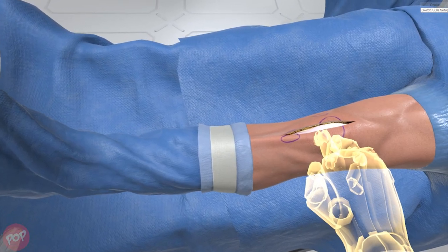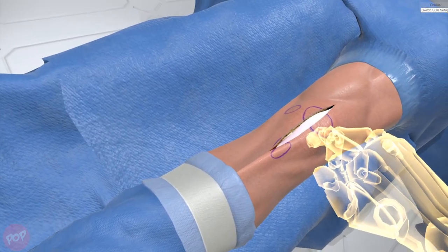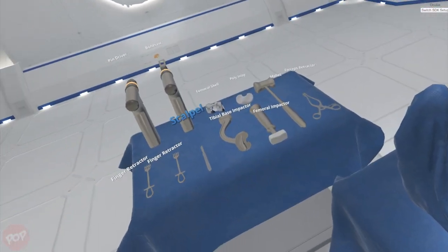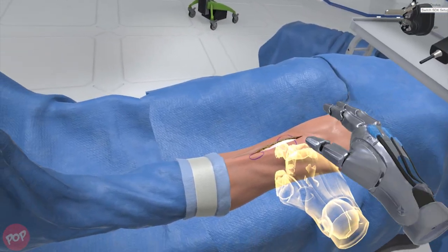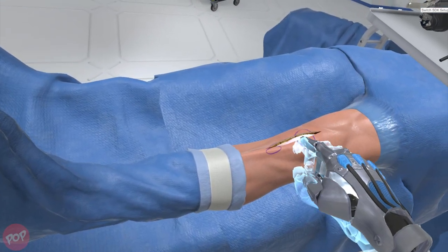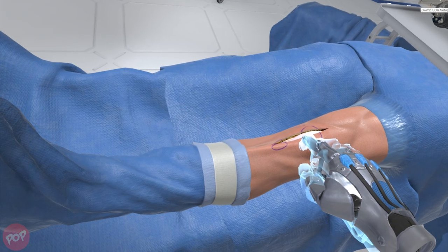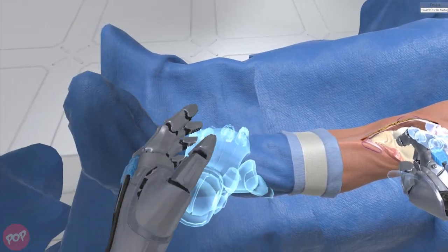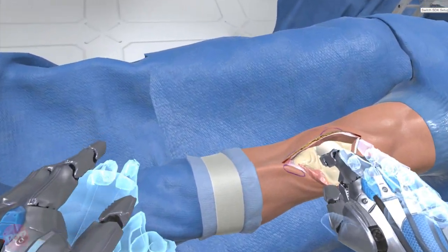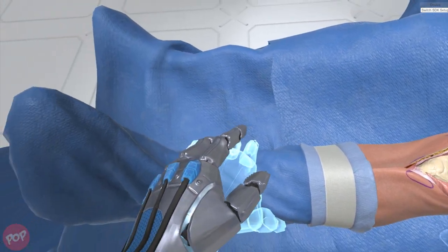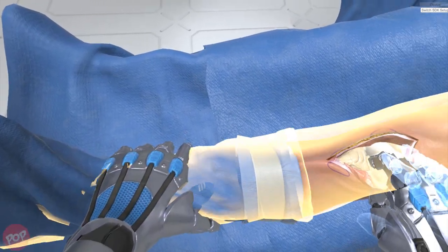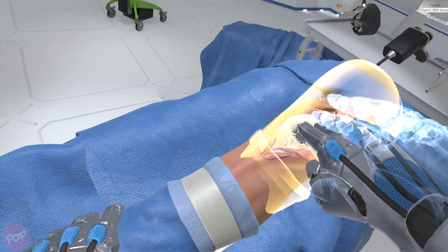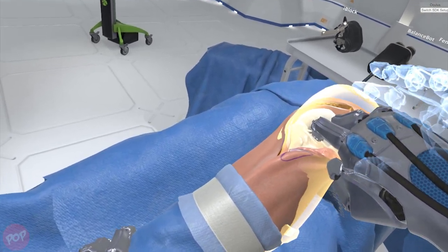Grasp the lateral margin of the full incision, preferably with your right hand. Pull the incision margin laterally, opening the incision and dislocating the patella laterally across the lateral femoral condyle. Hold the patella in lateral dislocation. Now manipulate the leg to reposition the knee into 90 degrees of flexion.